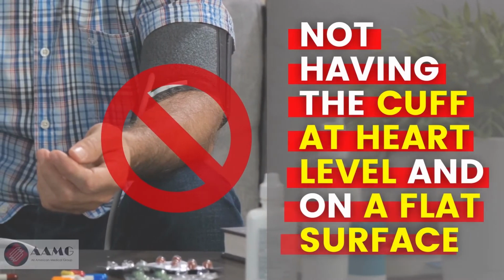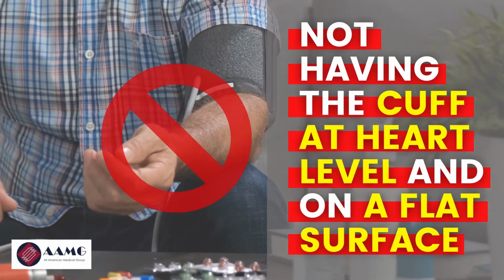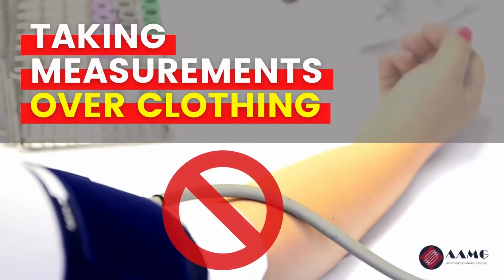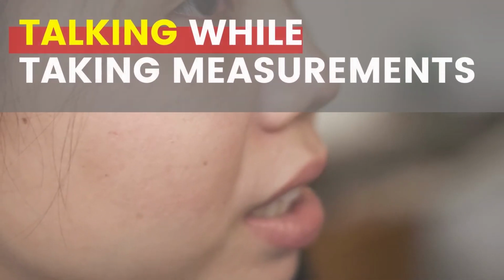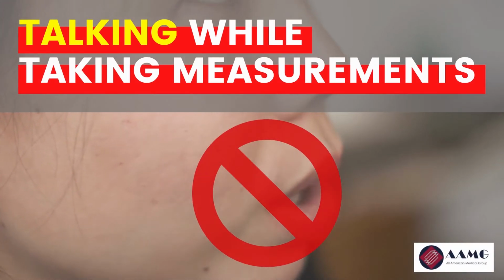Not having the cuff at heart level and on a hard, flat surface. Taking your measurements over clothing and not on your bare skin. Talking amongst yourself or with other people while taking your blood pressure.